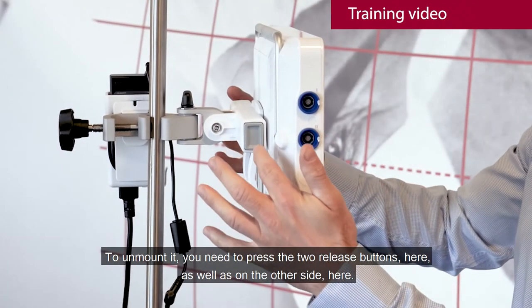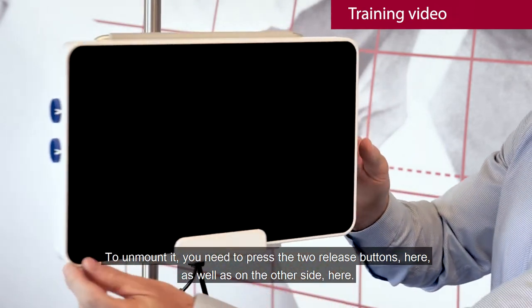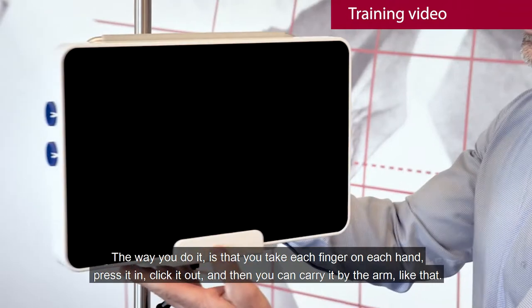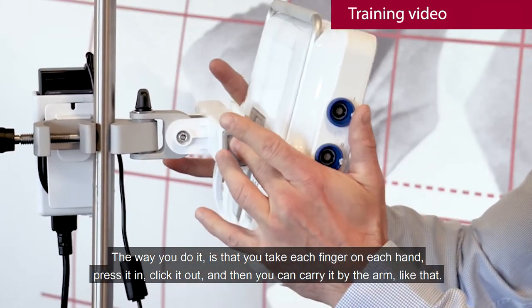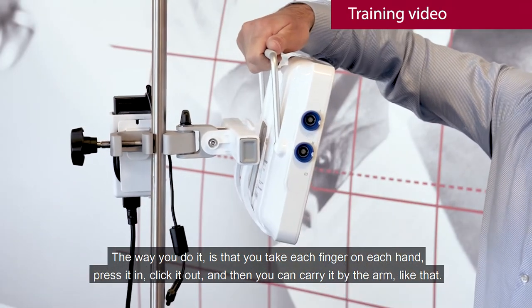To unmount it, you need to press the two release buttons here as well as on the other side here. The way you do it is that you take each finger on each hand, press it in, click it out, and then you can carry it with the arm like that.